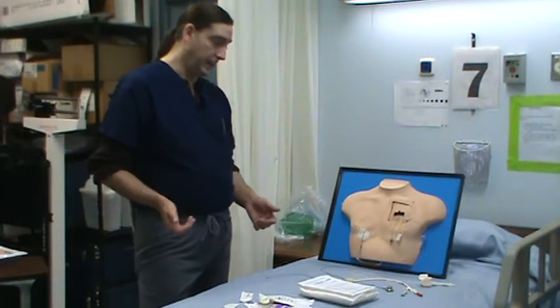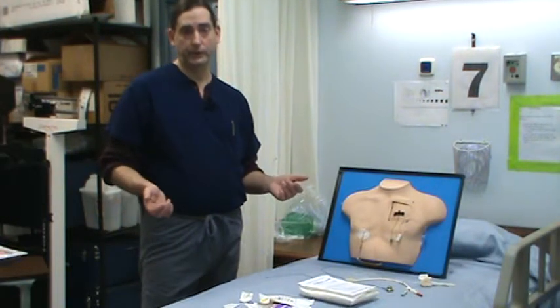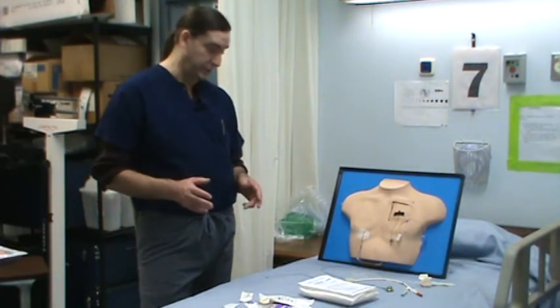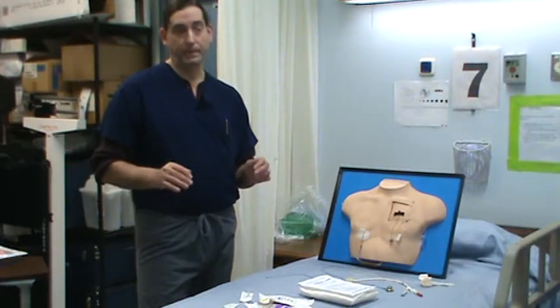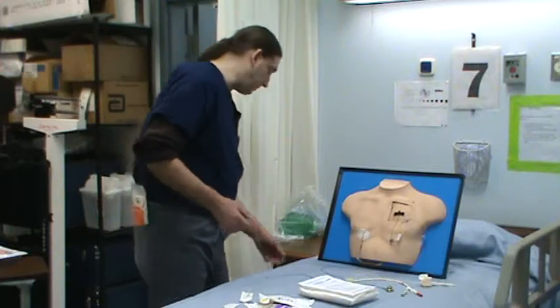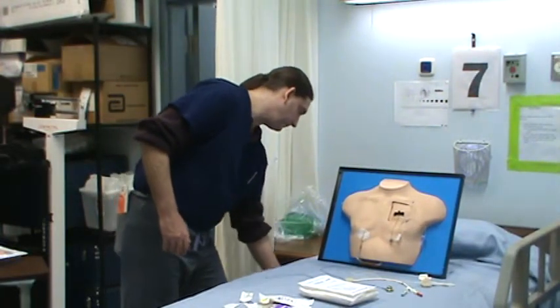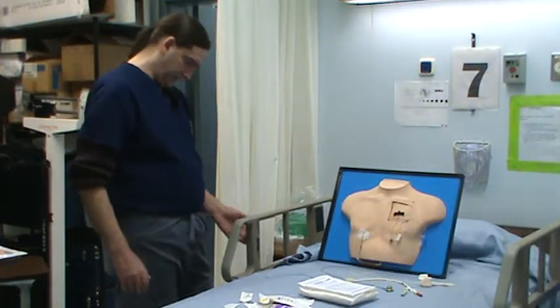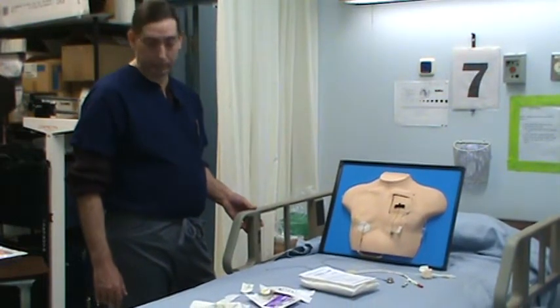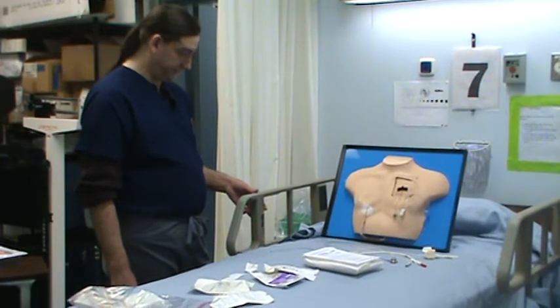To be honest, in 20 years I've never had to change a central line dressing on someone so confused they were in restraints. I have changed central line dressings on people that were sedated or unconscious. But I've never had a combative patient with a central line that I've had to change, thank goodness. So I would raise my bed to an appropriate working height for myself.